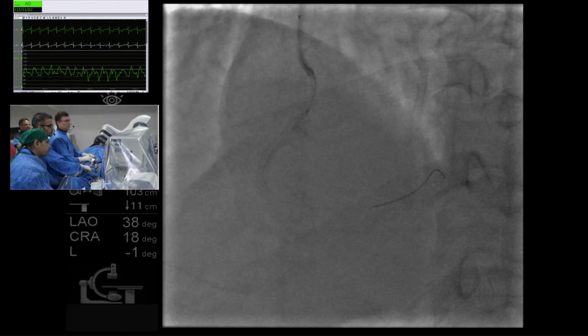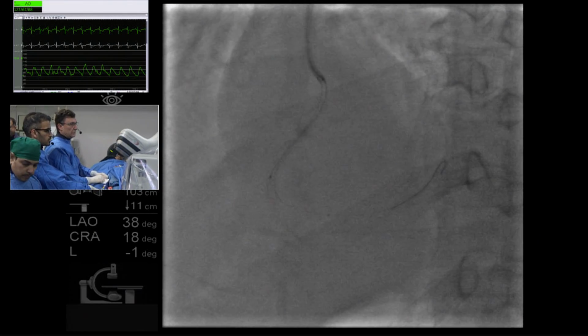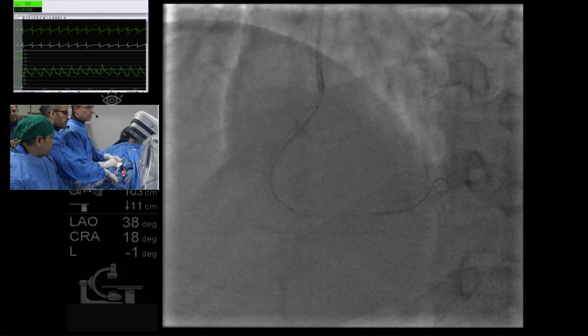I think it's getting a little bit caught there. The previous stainless steel stents, probably the polymer was also very thrombogenic, with Cypher and the likes. The polishing was not as good.